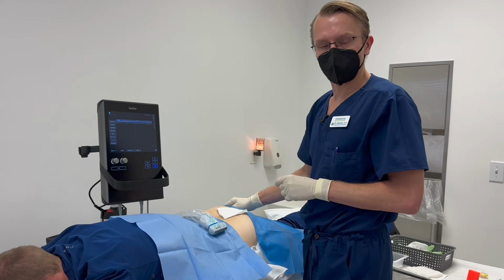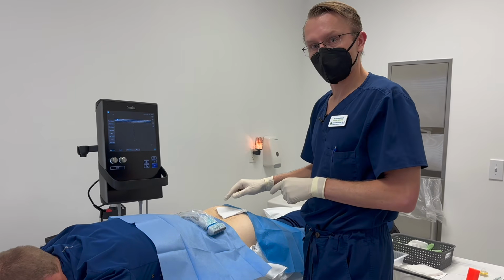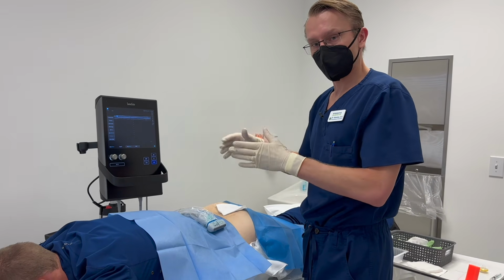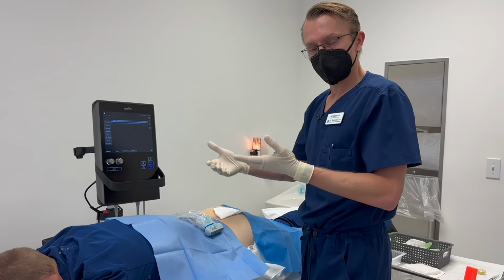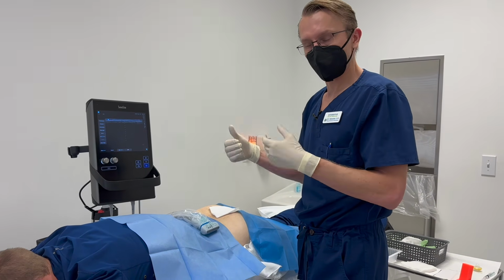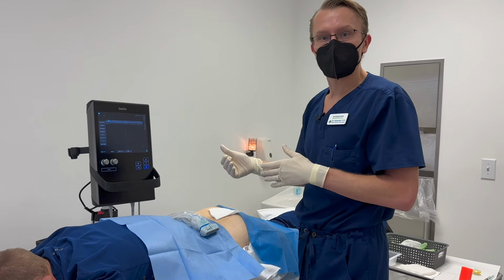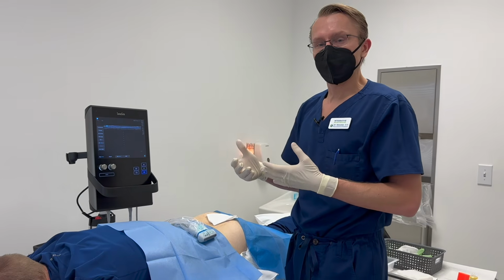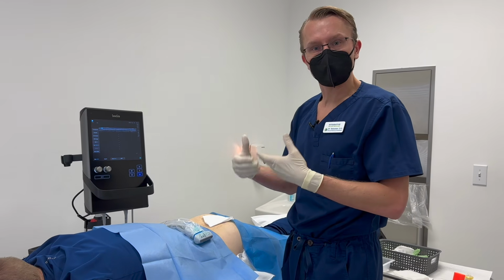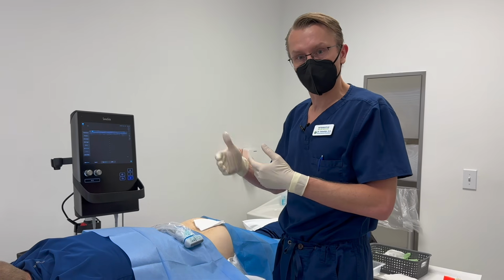So we're done with the caudal epidural injection. The platelet lysate traveled from the tailbone all the way to the spine. It's going to cover his disc and his nerves, and it's going to decrease the inflammation of those nerves, and help him decrease symptoms such as the numbness and the pain. The lysate also has some growth factors in it, and that will increase the healing of the nerves and the disc. And this will hopefully give us long-term results.